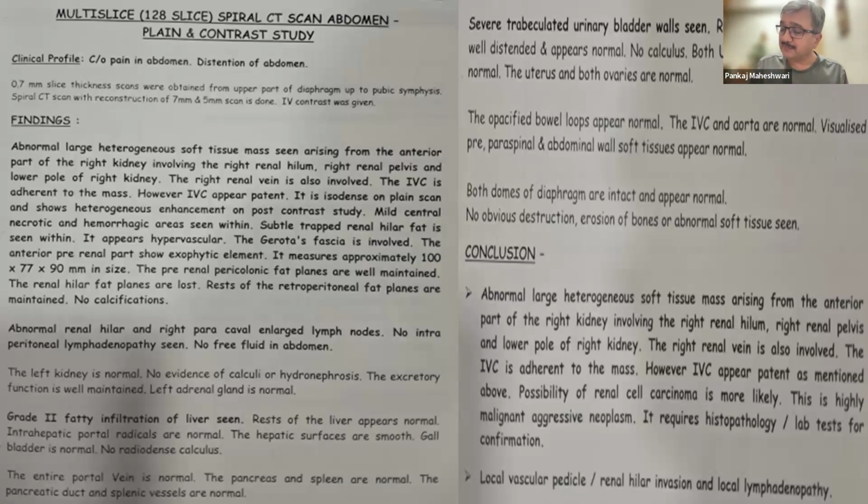Now, somebody asked for cystoscopy. If the patient doesn't have any lower urinary tract symptoms, why are you wanting to do a cystoscopy? You can very easily do a uroflowmetry beforehand to decide whether something needs to be done for the bladder. Seeing a marginally thick bladder does not mean anything, because the thickness of the bladder could very well be related to an incompletely filled bladder. So our decisions for cystoscopy are never based on thickness of bladder. They are based on the patient's symptoms and the uroflowmetry.